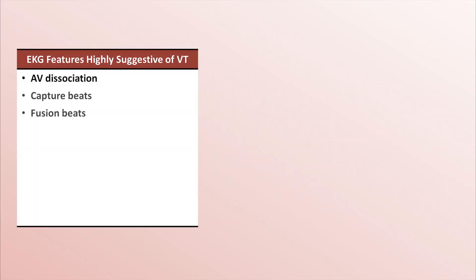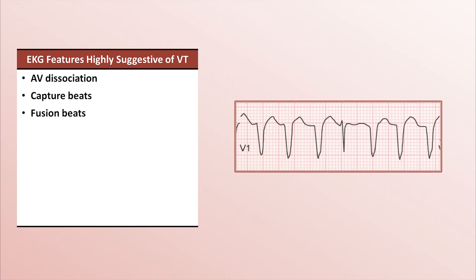Next on the list are capture and fusion beats. These are unexpectedly narrow and normal-looking beats or near-normal-looking beats within the middle of a run of regularly occurring wide complexes. This is due to a supraventricular impulse passing through the AV node and reaching the ventricles just before they would otherwise be depolarized by the surrounding ventricular tachycardia. When the QRS complex is completely normal, it's called a capture beat. When it's a hybrid of QRSs from a ventricular and a supraventricular origin — because the supraventricular impulse reaches the ventricles at the same time as they are being depolarized from the VT — that's called a fusion beat.